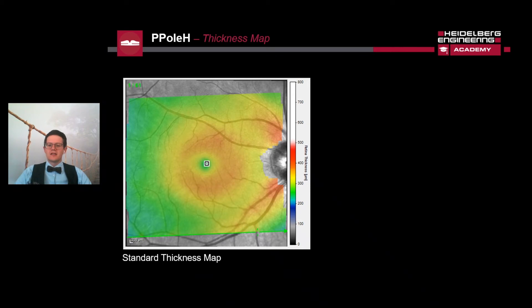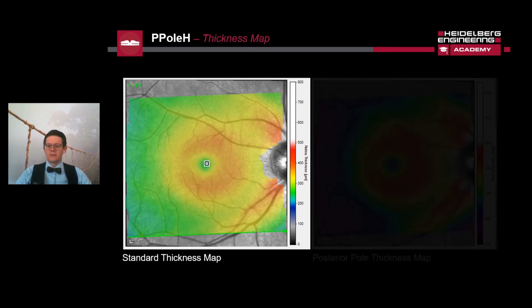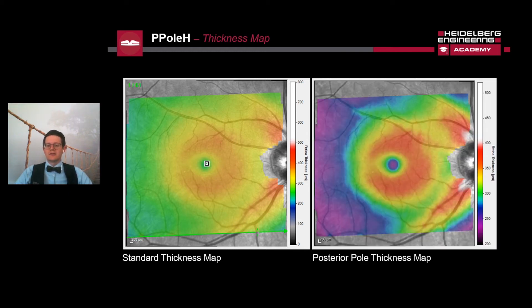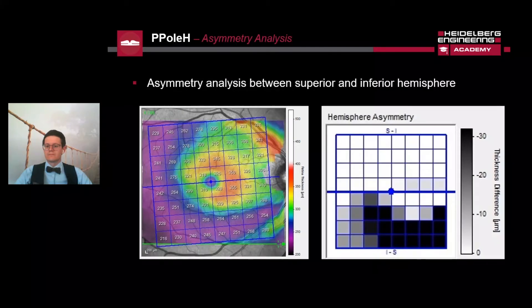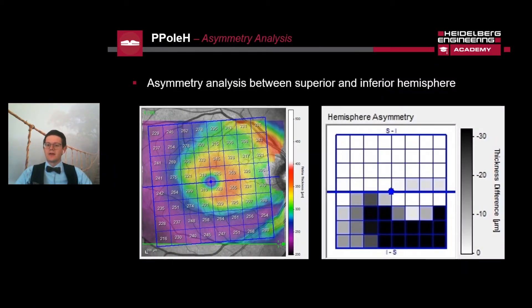The posterior pole scan has an additional thickness map. The standard thickness map is optimized for retinal detachments, with a scale from 0 to 800 microns. The posterior pole thickness map is optimized for structural changes caused by glaucoma, with a range from 200 to 550 microns. Ideally, the posterior pole thickness map of a normal eye looks like the wing of a butterfly. The thickness map is not the only tool the P-pole analyzer offers, because asymmetry is also a hallmark of glaucoma.